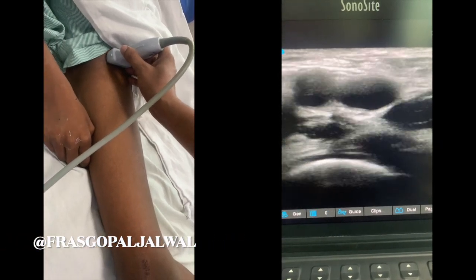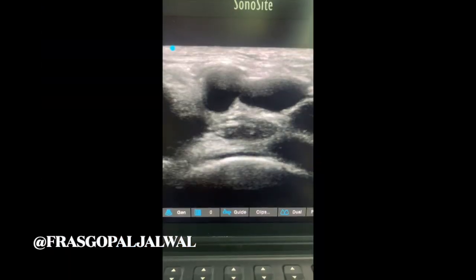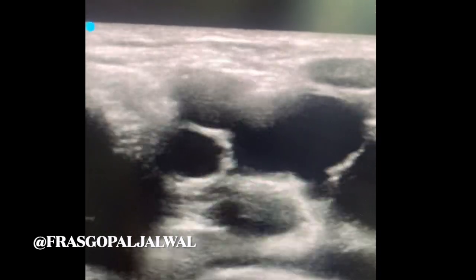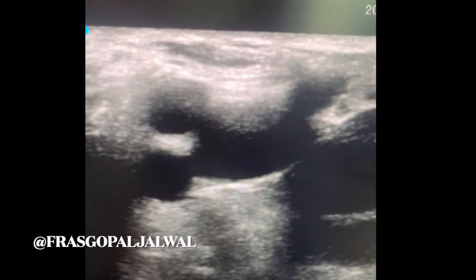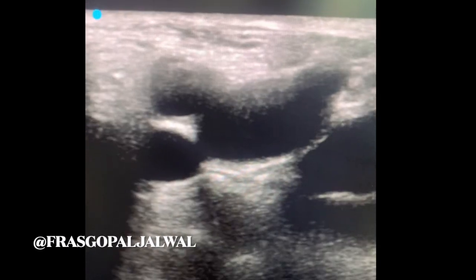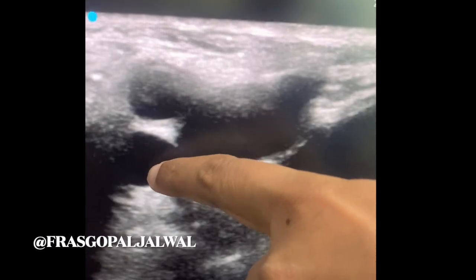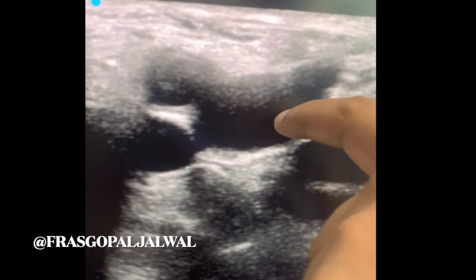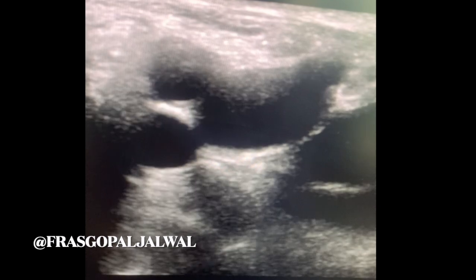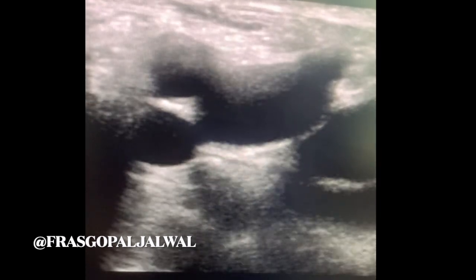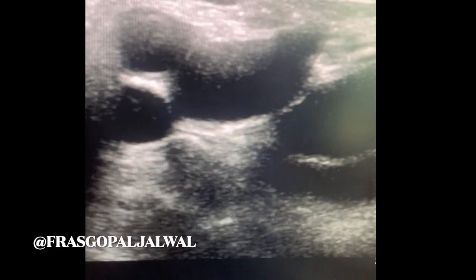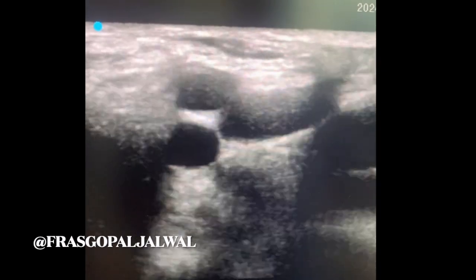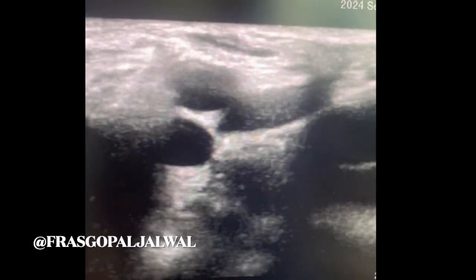Now I am moving my probe in a caudal direction, around 2 cm below the inguinal crease, where you will see a Mickey Mouse appearance. In the Mickey Mouse appearance, this is the femoral artery, this is the profunda femoral artery, and this is the femoral vein. You can also see another vein arising from the common femoral vein — that is the great saphenous vein. Again, we compress the vein to assess whether the anterior and posterior walls are touching each other. You can see the anterior and posterior walls of the femoral vein and great saphenous vein are touching each other, meaning there is no thrombus inside the femoral vein.